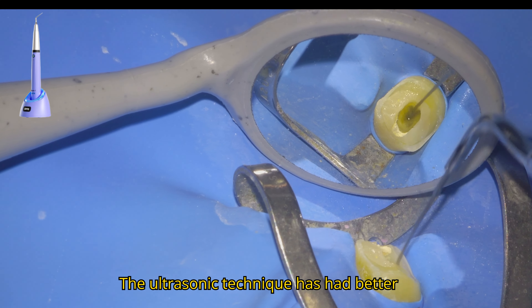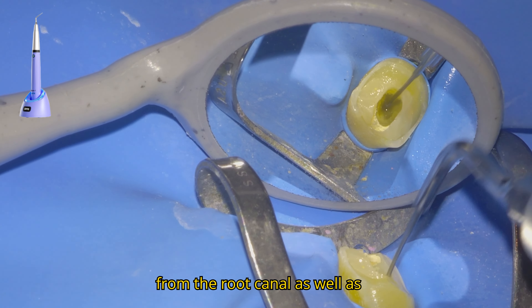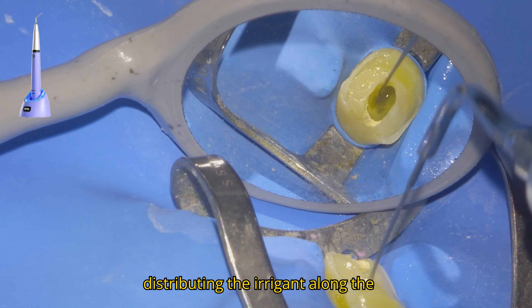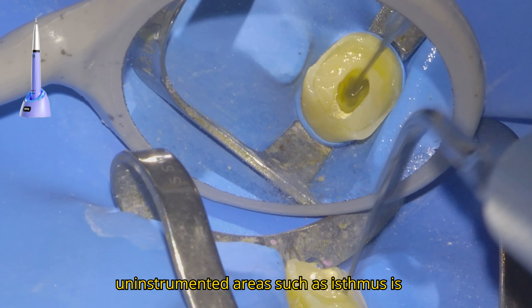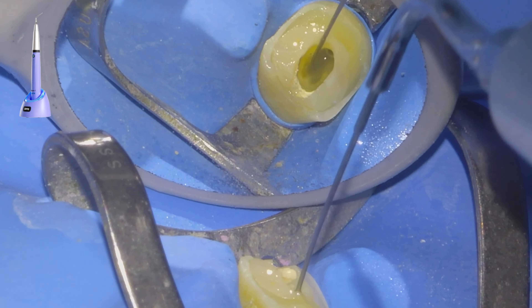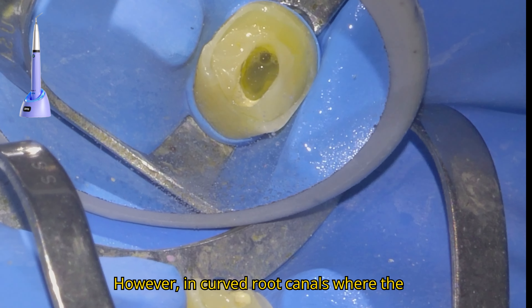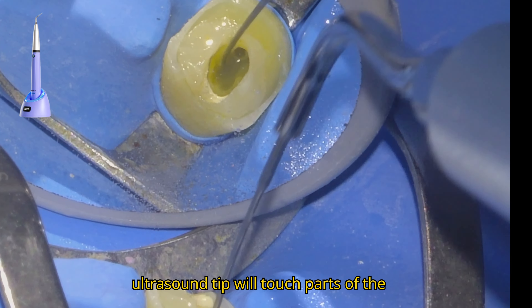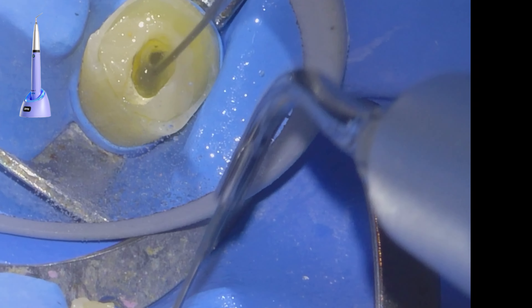The ultrasonic technique has shown better results when it comes to removing debris from the root canal, as well as distributing the irrigant along the canal, and penetrating uninstrumented areas such as isthmuses compared to sonic activation. However, in curved root canals where the ultrasound tip will touch parts of the canal, I prefer to use the endoactivator.